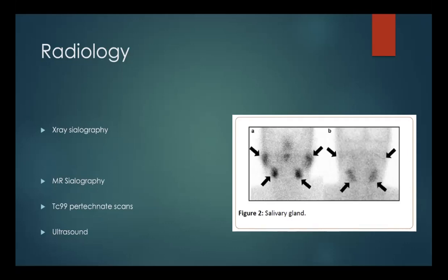However, it has largely fallen out of favor because of the ductal inflammation that the radiopaque dye can cause. And of course, once you subject the patient to a sialography, you cannot really do a treatment for the next week or 10 days. MR sialography has emerged because of all the shortcomings with the conventional sialography. And I shall be going into more detail about that later.